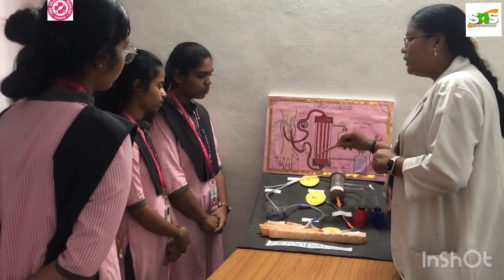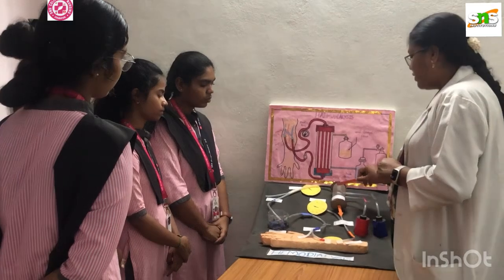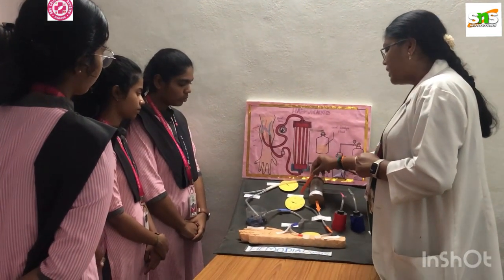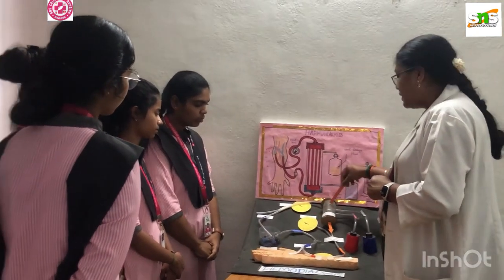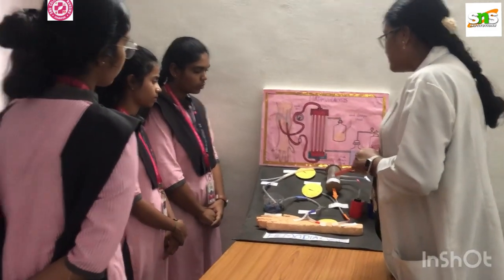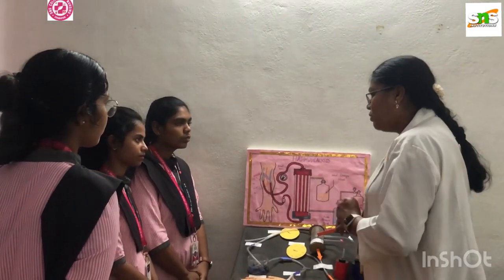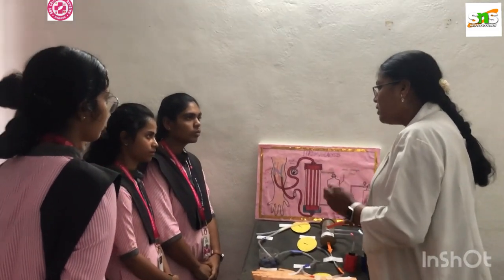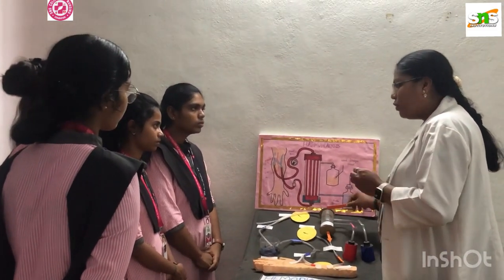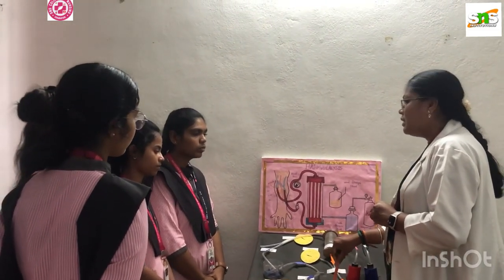So the role of the nephrons is taken up in this dialyzer. We have a dialyzer inflow pressure monitor and a venous pressure monitor attached with the dialyzer and the blood flow and fluid tubings. After the dialysis is over, we make sure that the electrolytes are removed: sodium, urea, creatinine and excess potassium will all be removed. The purified blood will enter another tubing and be connected towards the AV fistula.